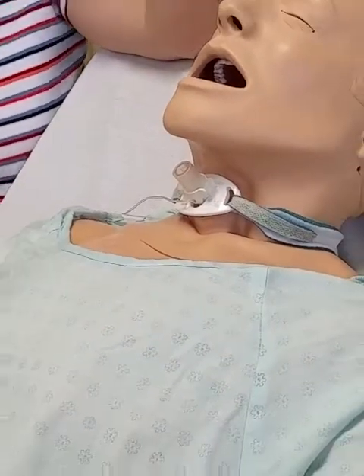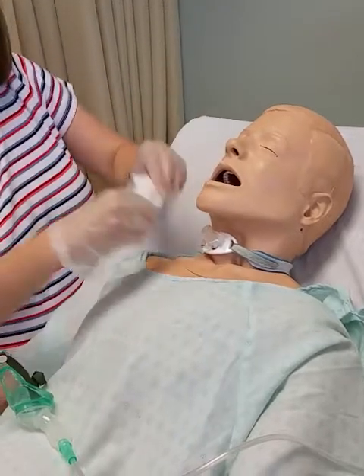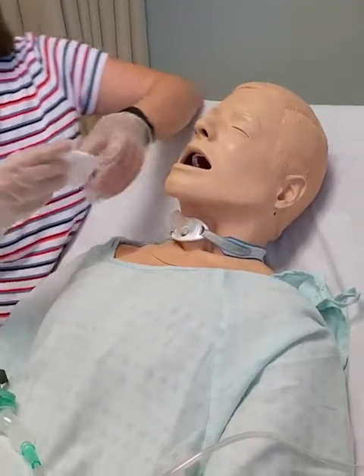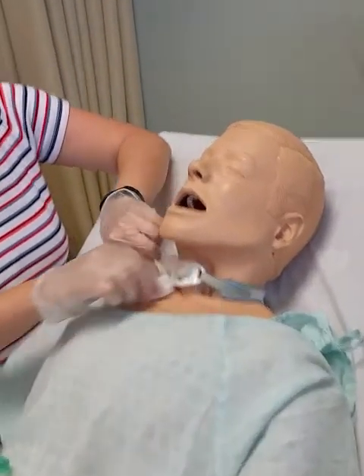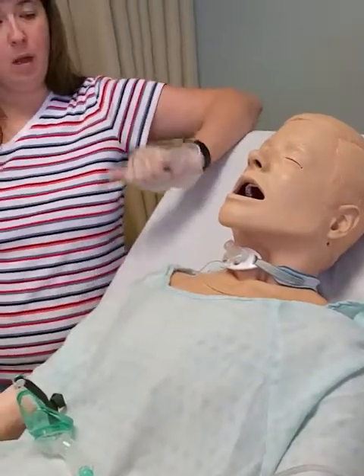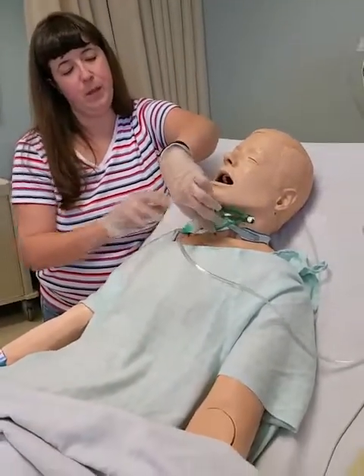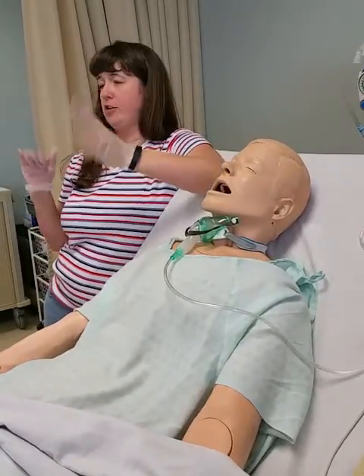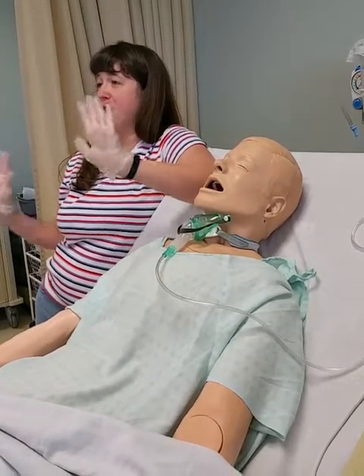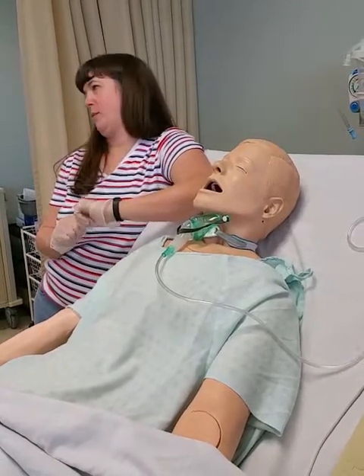Okay. And last but not least, I just need to dry it. So I'm going to dry the skin down on the bottom, dry off the faceplate. Okay. So the care part, other than putting the drain sponge back on, is done. Now, you guys can decide, do you want to change trach ties first, or do you want to put the drain sponge back on first? I changed my trach ties first, because the Velcro of the trach tie gets stuck to the drain sponge.